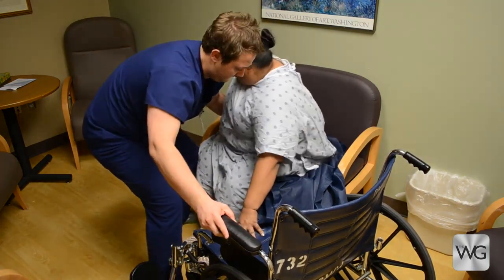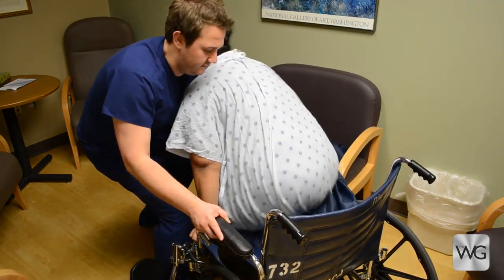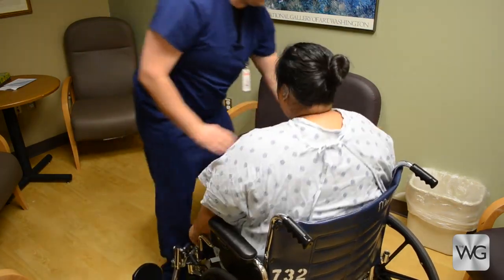The patient is instructed to scoot and slide her bottom on the folded slide sheet and slide from the bedside chair into the wheelchair.